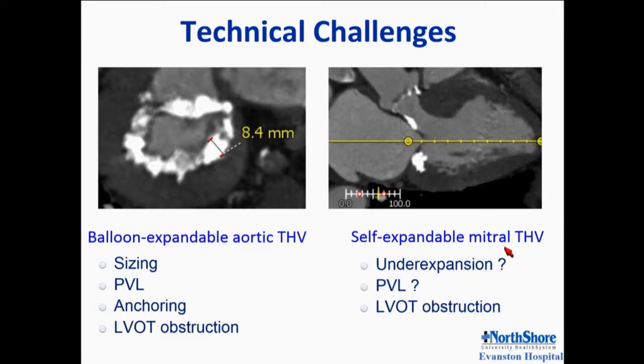The experience with transcatheter mitral devices that are self-expandable is early, but one potential challenge will be that you may not achieve full expansion of the device due to restrictions related to the presence of calcium. Can you have paravalvular leak if your valve is underexpanded? And also the risk of LVOT obstruction like in the other one.